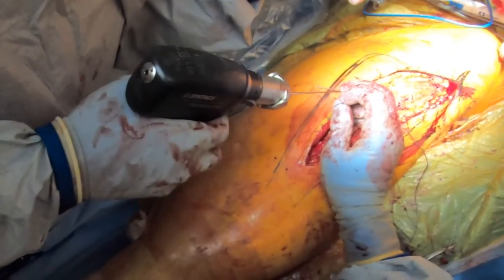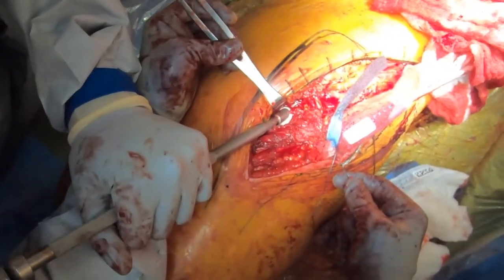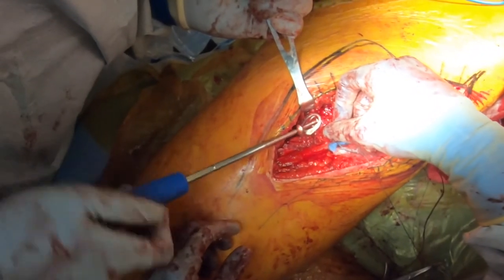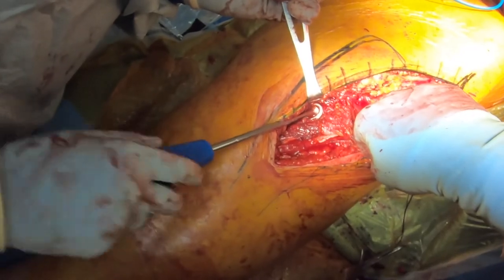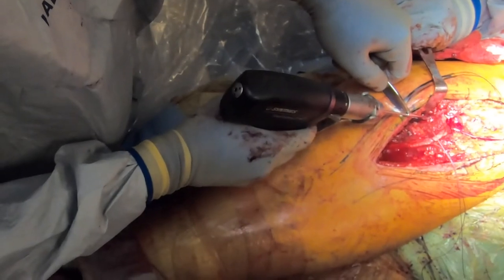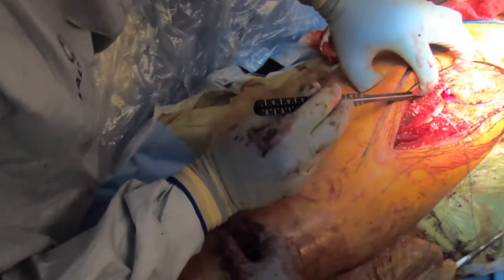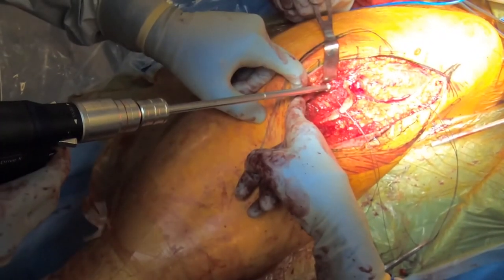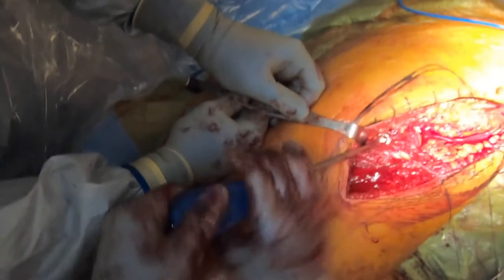The K-wires are then removed. A compression screw is then placed over the side plate after the side plate is locked in place. A separate cannulated screw to act as a derotational screw is then placed cranial to the helical blade. A partially threaded 7.3 millimeter cannulated screw is then placed. The compression screw is then removed.